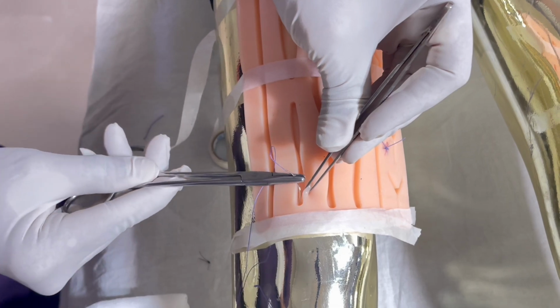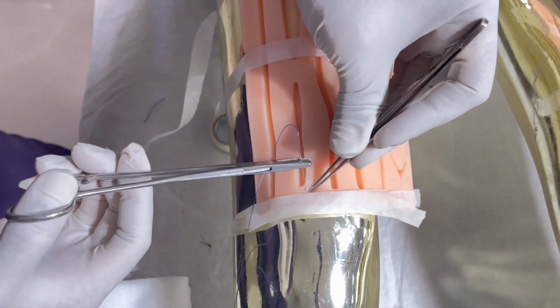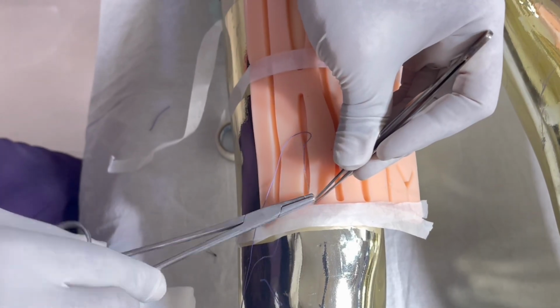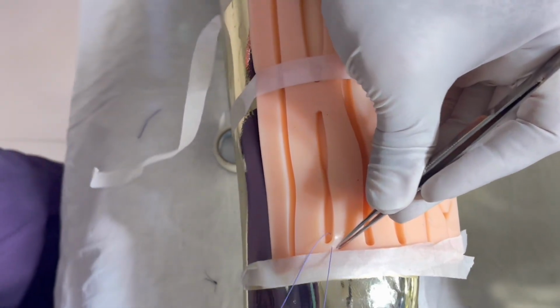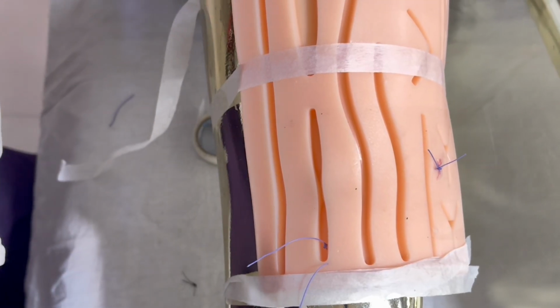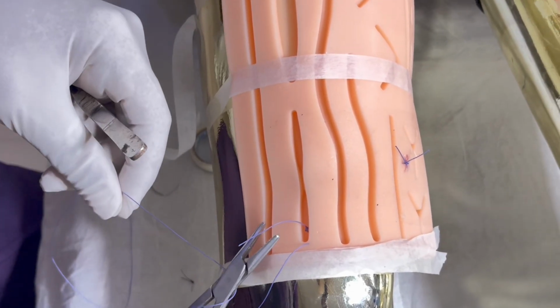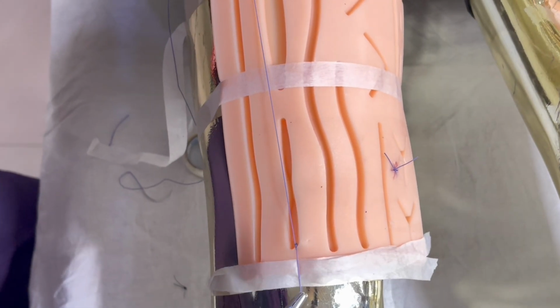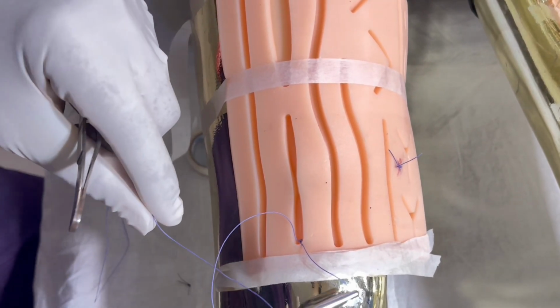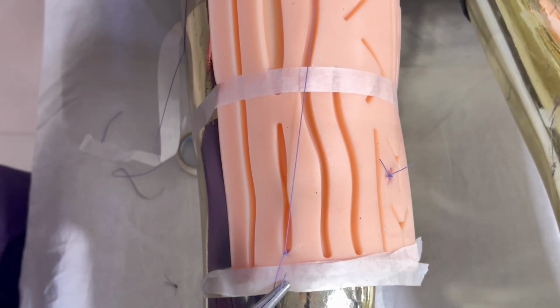I just have to take it at the end and bring it out. So this knot will be going inside. This is the burying of the knot.